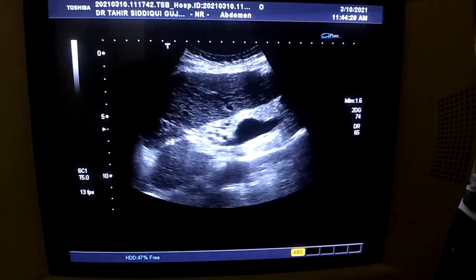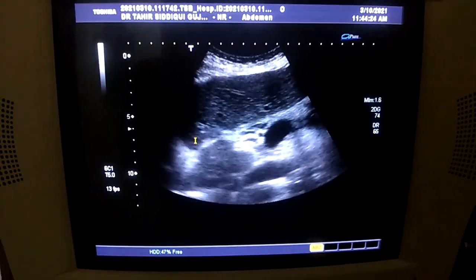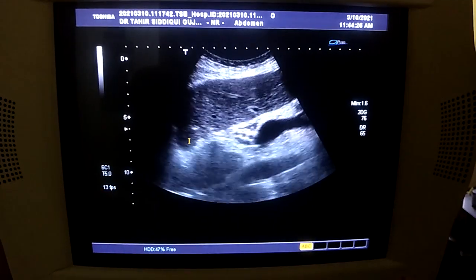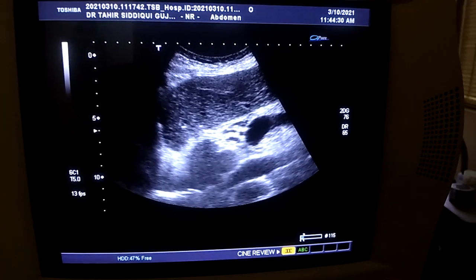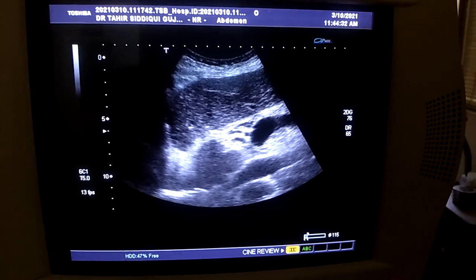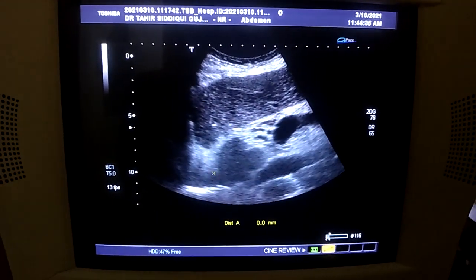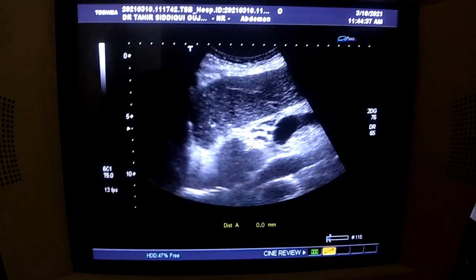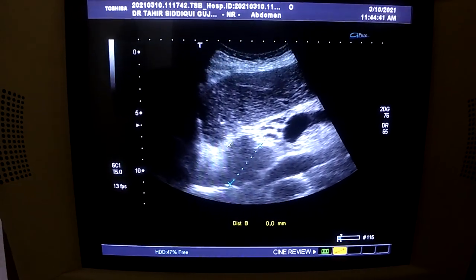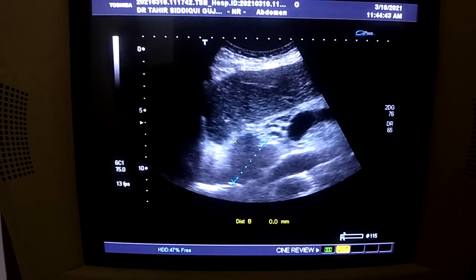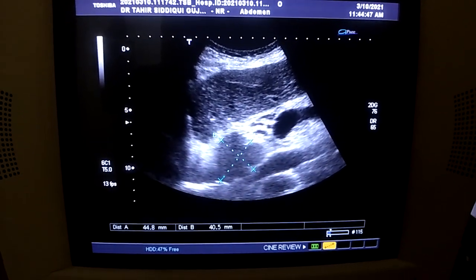As I always say, always be 200% sure in a normal study. Unless you are 100, 200% good in a normal study, you will make a mistake like this. This is the area which has been labeled as an epigastric mass.